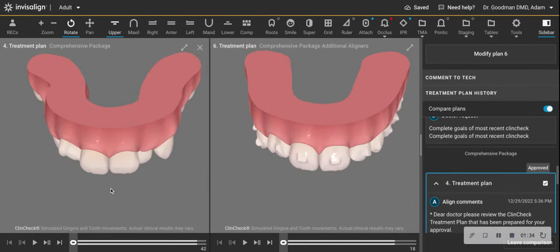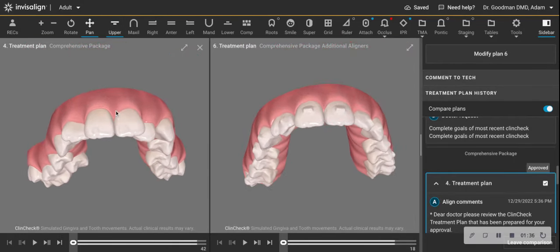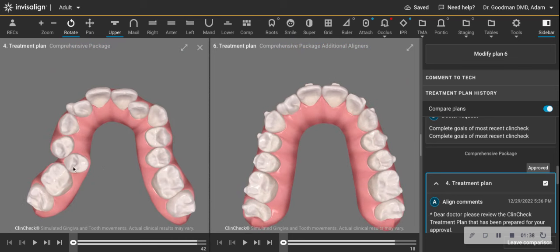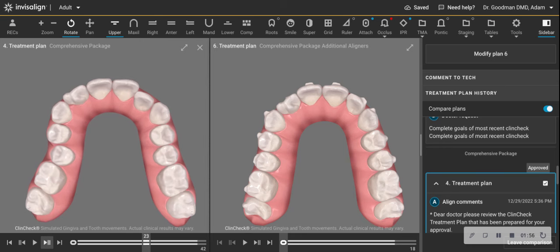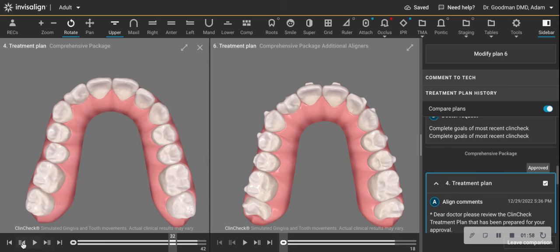And on the upper, it's even more of a challenge because this patient had tooth number 4 that was completely displaced lingually. And reflexively, I would have thought to remove this tooth. But I said, you know what, if I do that, then I have to remove the other 3 premolars for balance, 1 here, 2 on the bottom. And when I saw the lower, I said, let me take a look. So I planned this out, broadening the arch in all dimensions, just using aligners at the proper sequence.